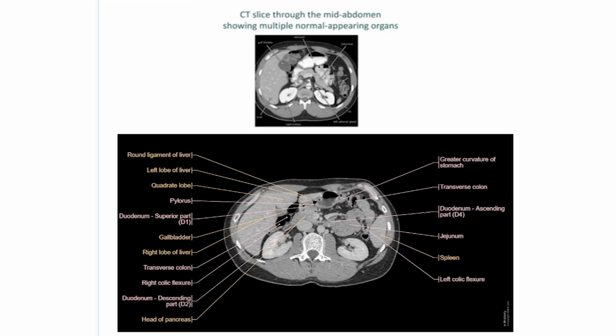Now, with a brief revision, I would like to complete my today's lecture on computed tomography. I have covered the drawbacks of conventional X-ray imaging. I have also compared the CT with MRI and ultrasound imaging. I have covered the basis of image reconstruction in CT. I have also covered the CT scan machine and its block diagram by explaining the function of each block. I have also covered the applications of CT.